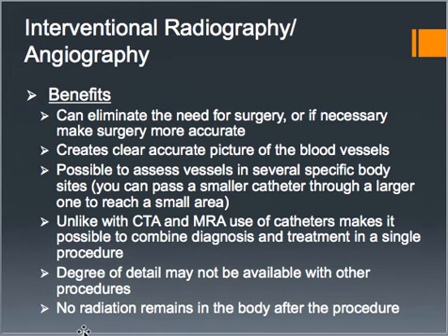Benefits. There are quite a few benefits for interventional radiology. So angiography can eliminate the need for surgery. That's huge, right? If you have the choice between a minimally invasive study and surgery, which would you choose? So if by chance the surgery is still necessary, it actually makes the surgery more accurate, because they know exactly what's going on since they have the imaging to back it up.